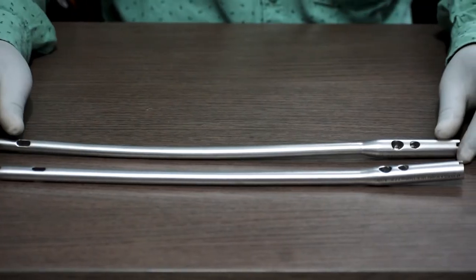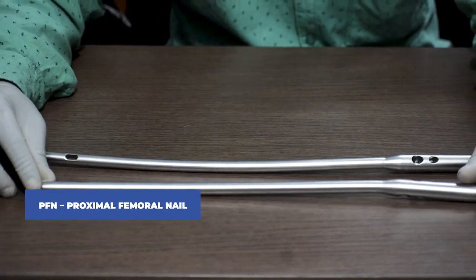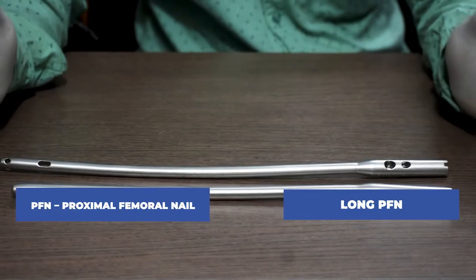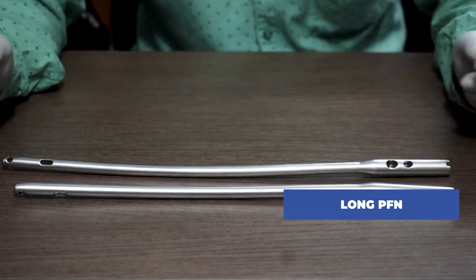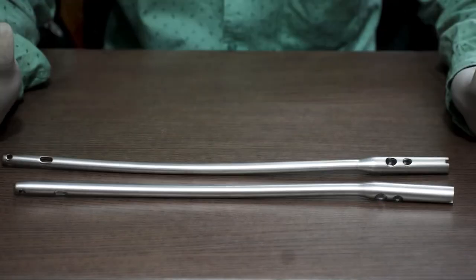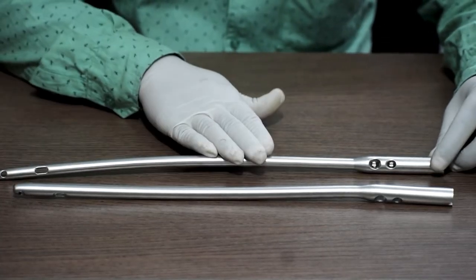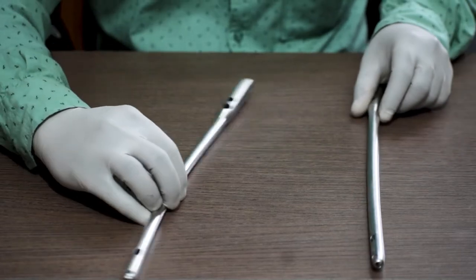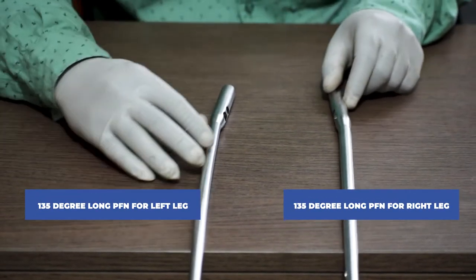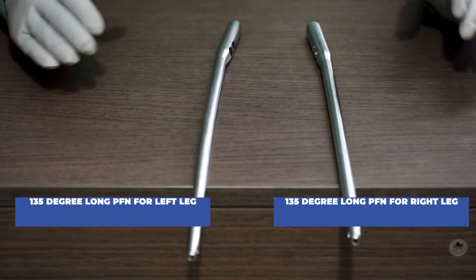Next, this is a long PFN. This is the long PFN available in 130 degree and 135 degree and is also available for left leg and right leg separately. Like here, this is a 135 degree long PFN for left leg. And this one is long PFN 135 degree for right leg.